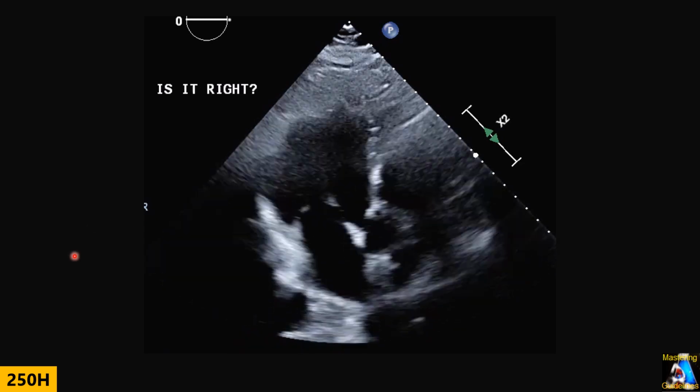What about this view? You are getting the apical three again, but you get this one. Is that a correct apical three or not, based on those landmarks and whatever you know? And if it's not, how can we fix it and make it a correct apical three?